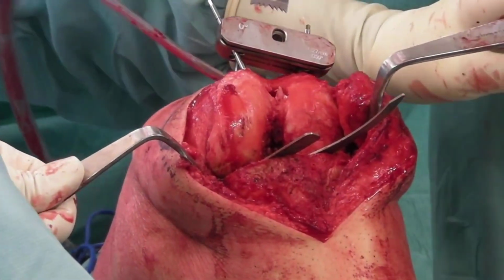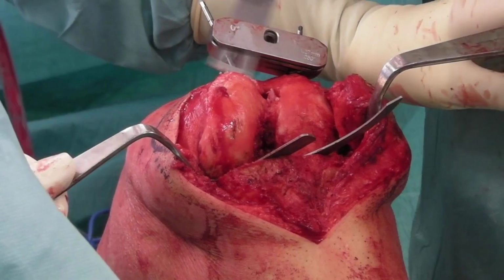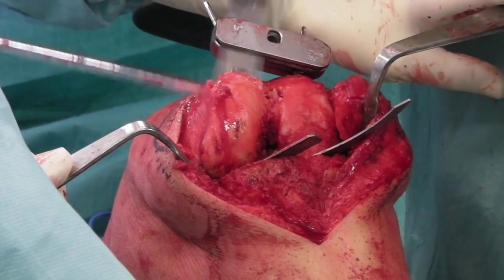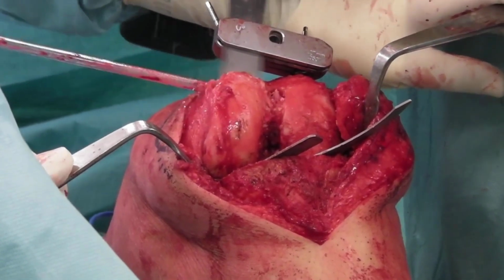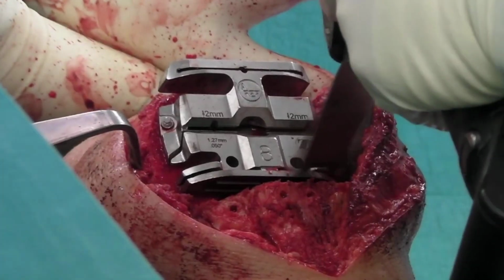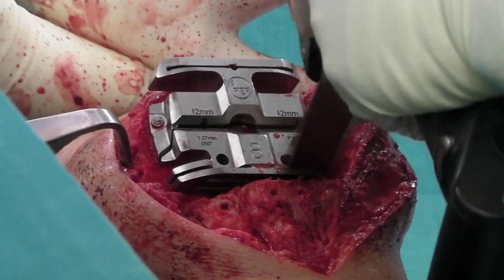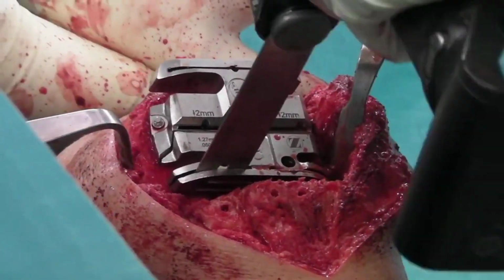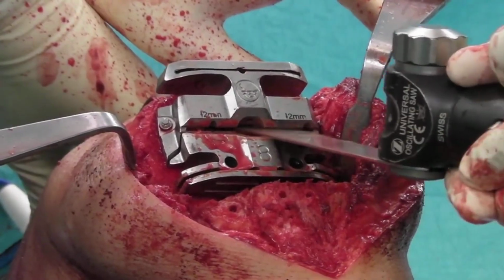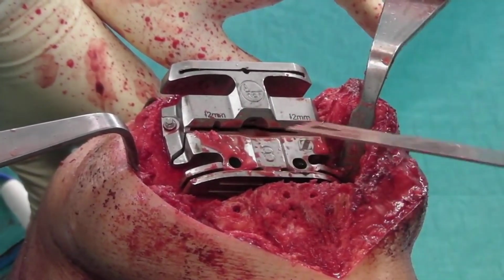Once the tibial plateau has been cut, we move on to cutting the femur, which involves several steps in a precise sequence. Please note that bone cuts must be made with a saw, because bone is a rather hard and resistant tissue. The first of these steps is the vertical cut, followed by horizontal and oblique cuts. The special feature of this guide is that it has several grooves to guide the saw in different directions without having to change the guide each time.